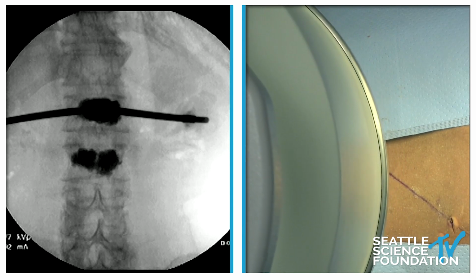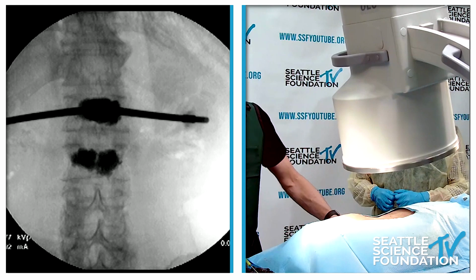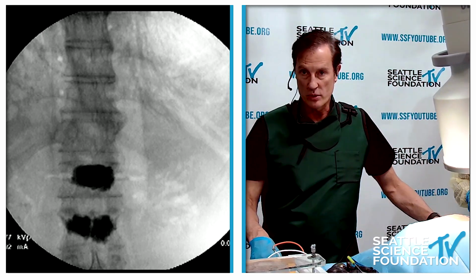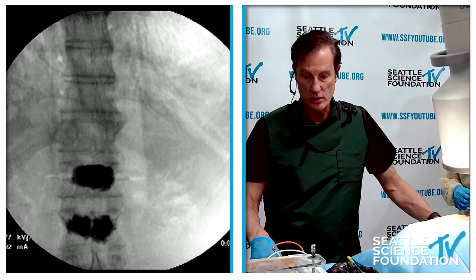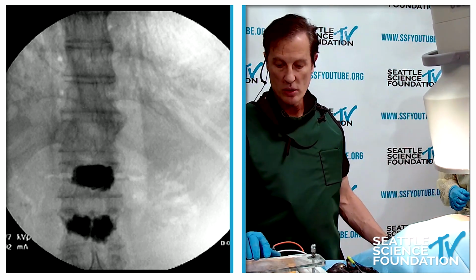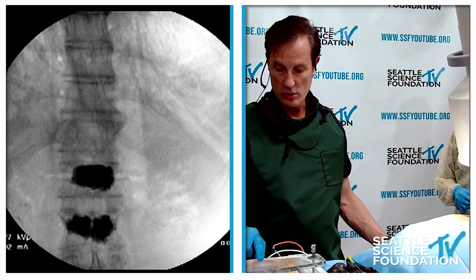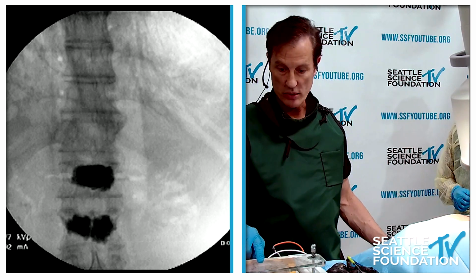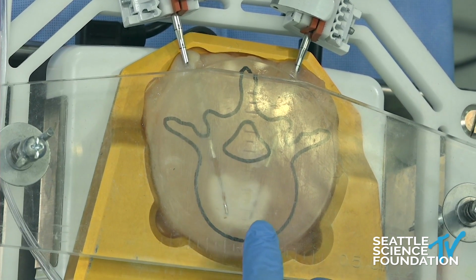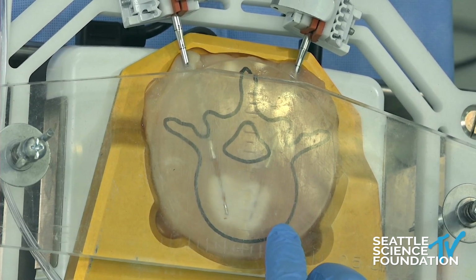And we just finished the burn. We started with 13 minutes, and with the explanation and everything else, even starting to deploy, the whole procedural time for this was just slightly over 13 minutes. Let's take one more final view here of the elliptical burn, the radiofrequency ablation zone. This is designed as the Osteocool, so this is the ablation zone in the anterior portion of the vertebral body. This is done with a combination of two probes, and here we can see the color change in the chicken breast, demarcating the ablation zone of the RF.